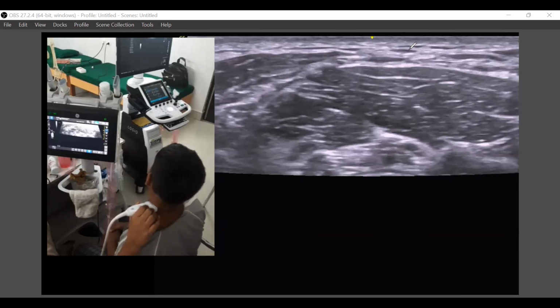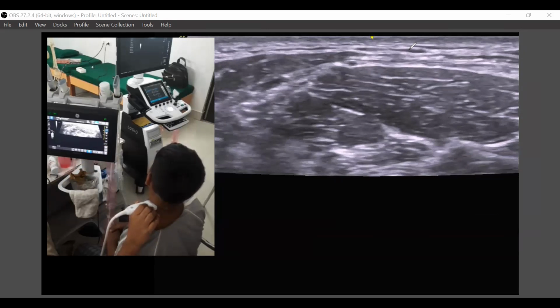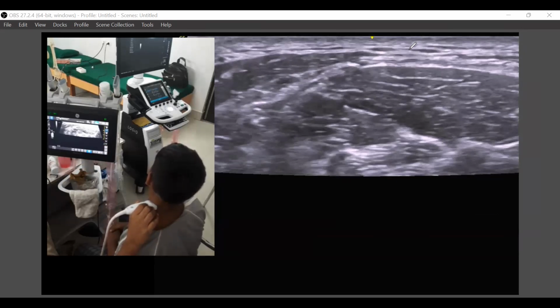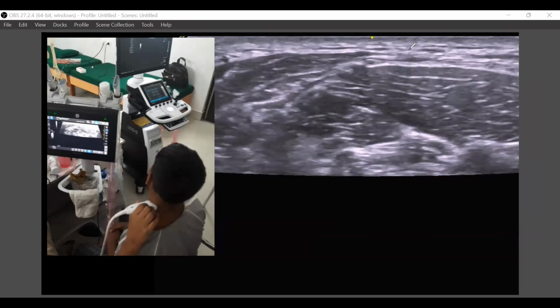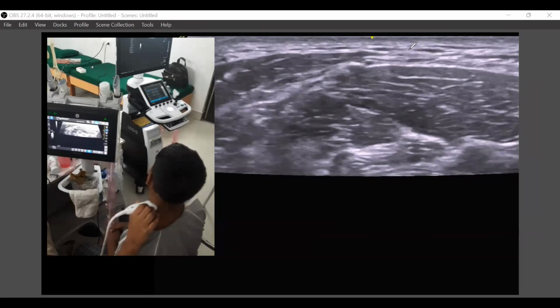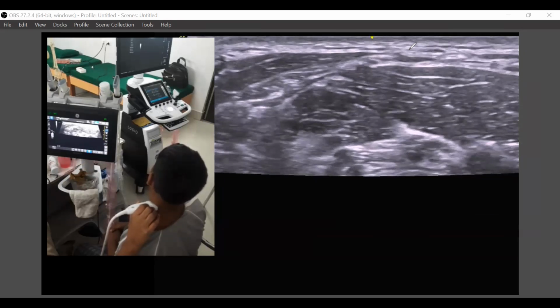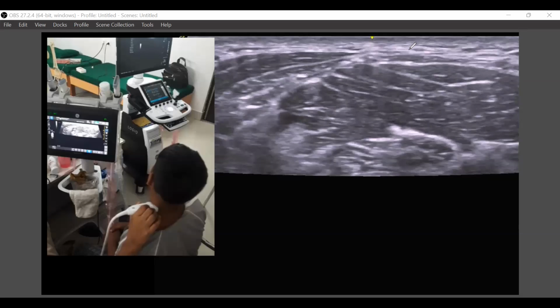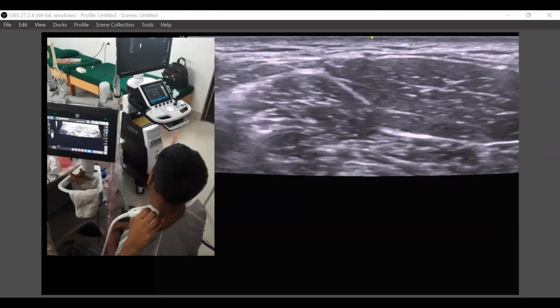Look at what I was telling. You see one nerve is coming down. Follow this nerve, which is exactly below, just at the edge of the sternocleidomastoid. Can everybody appreciate that nerve? That nerve coming below the sternocleidomastoid is the spinal accessory nerve. Follow this nerve; I'm keeping it exactly at the center.